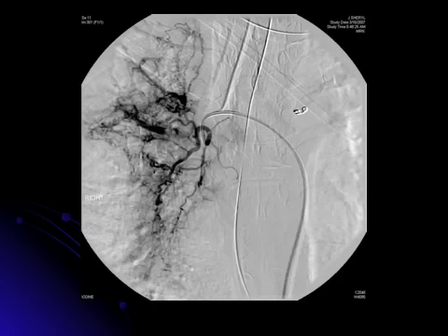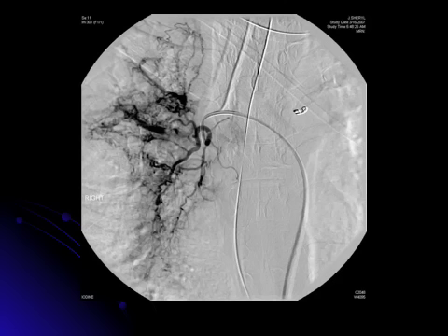This catheter was advanced distally and as you can see there is collateralization from the bronchial artery branches to the large pulmonary vein in the center of the field. These were then embolized using biospheres measuring 500 to 700 microns in size, as the collaterals from the bronchial artery to the pulmonary vein measure approximately 250 microns in size.